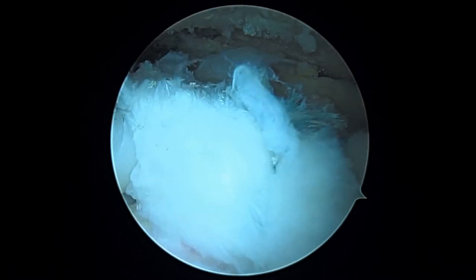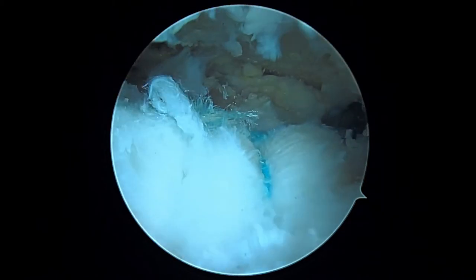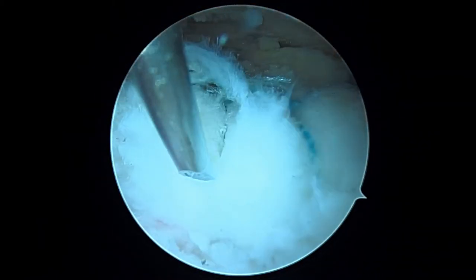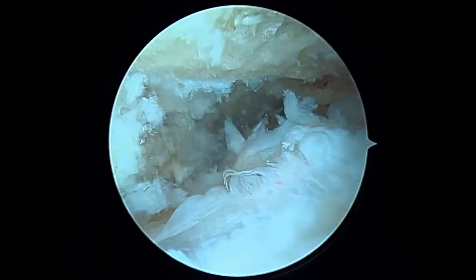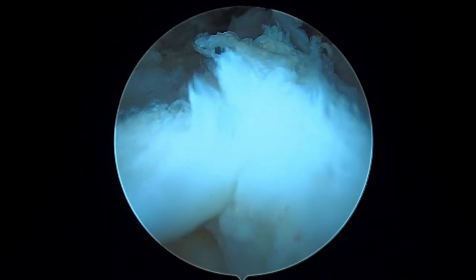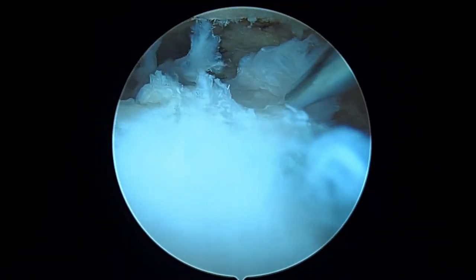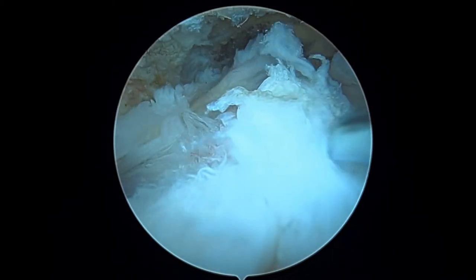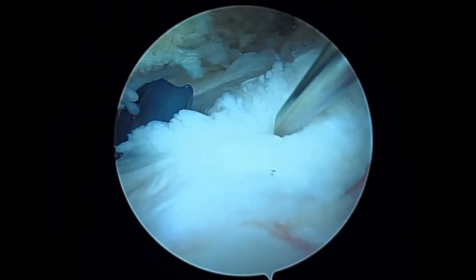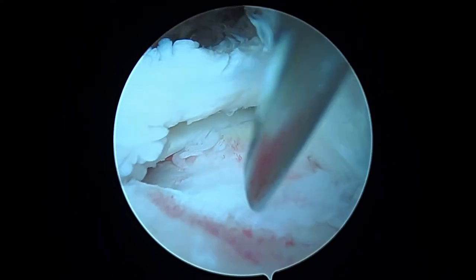Here's where we're at so far: we've got that first anchor in and all three of those sutures are tied back here — one, two, three. We also put in a side-to-side stitch, something we call a rip stop stitch, holding down a split in the tendon back in this region. Now we've got most of this tear fixed, but we've still got to get this remaining portion down, so we're going to place another suture anchor.